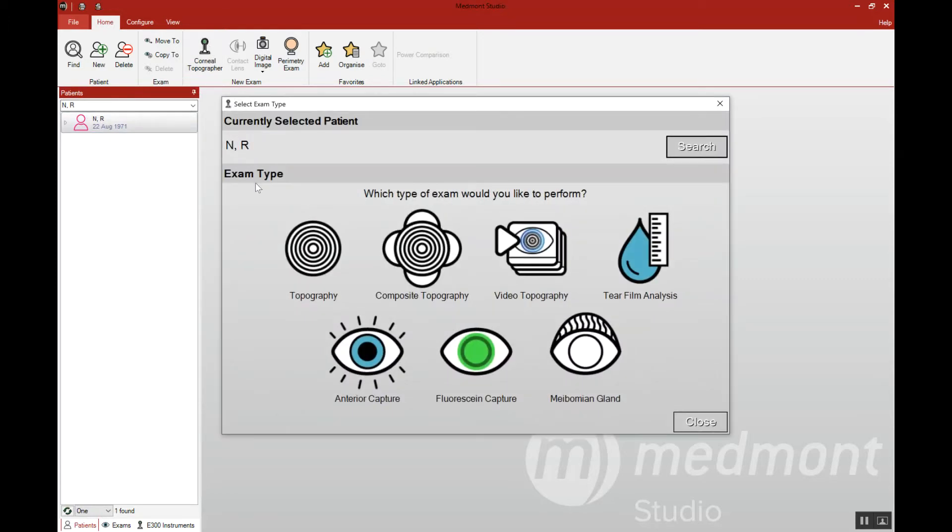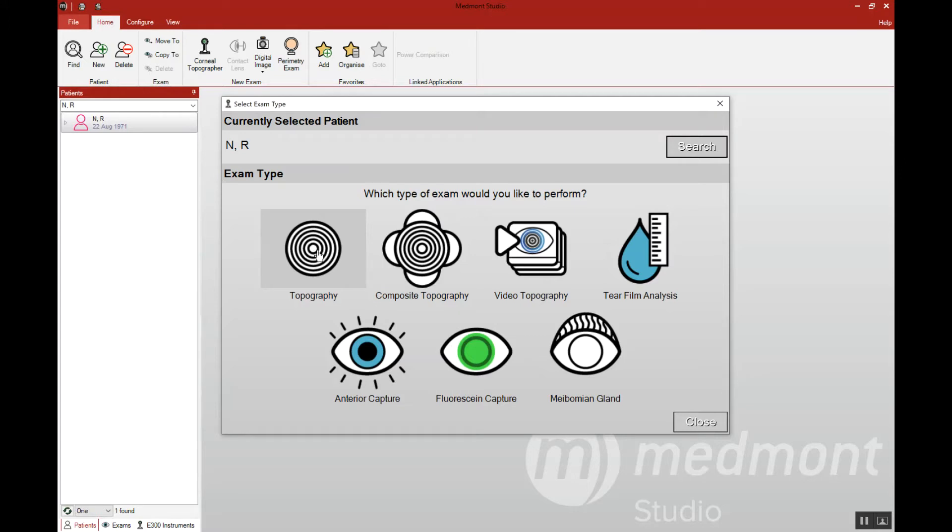That will bring up the various options that we have for capture. Let's begin with a standard topography capture. This is the one that we use for any screenings. If we were trying to understand the general eye shape, this is the one that you're going to use most often related to topography capture.